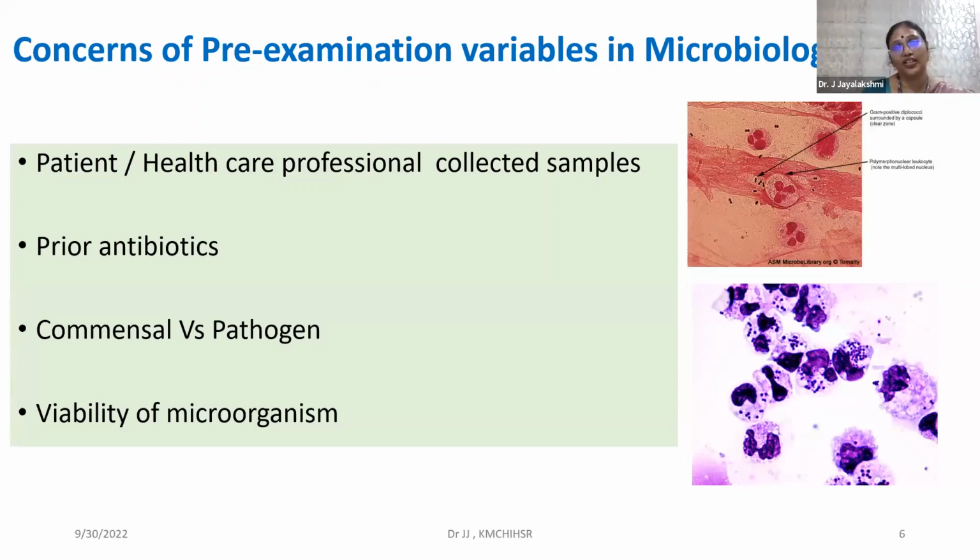And somebody knowledgeable has to guide them through the process of receiving the sample and starting to process the sample. So these are the areas of concern that we would have in a microbiology laboratory setting.